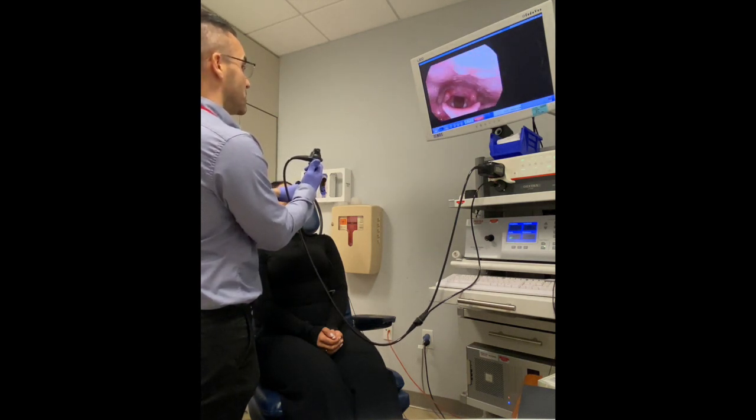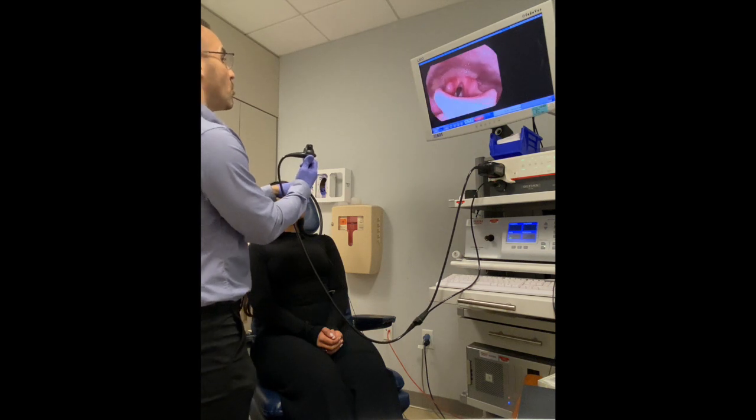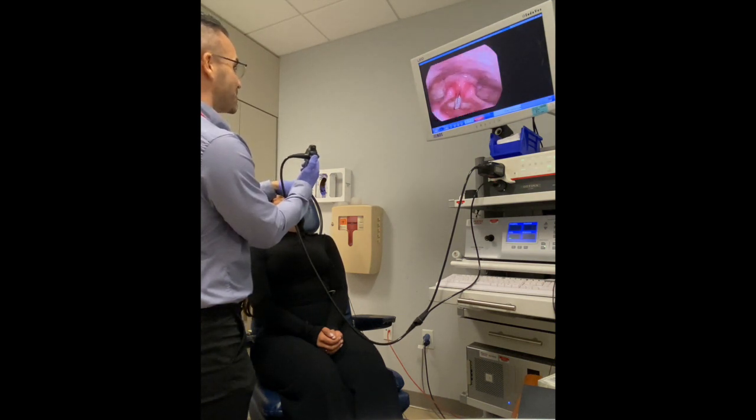Those are your vocal folds. You can see right now they're kind of open a little bit like a V. And they come together when you hold your breath or when you use your voice. Go ahead and say E again and notice how they come together. — E. — Excellent. Now do a nice slow sniff and see how they open out like a V. And you see how they're apart there?